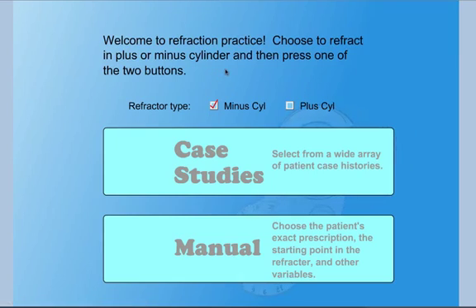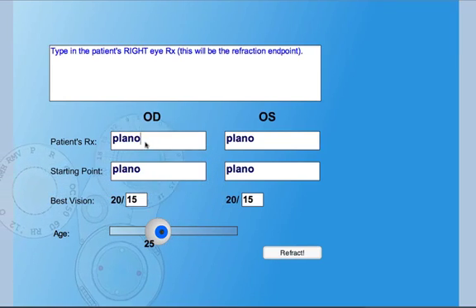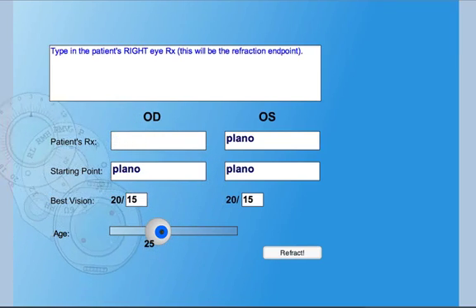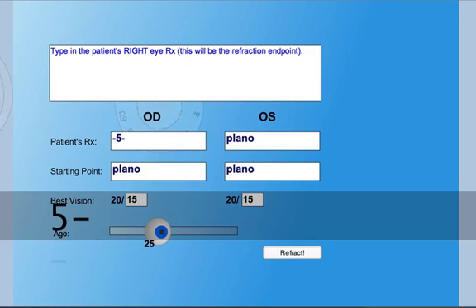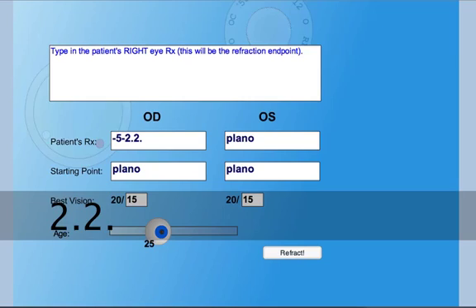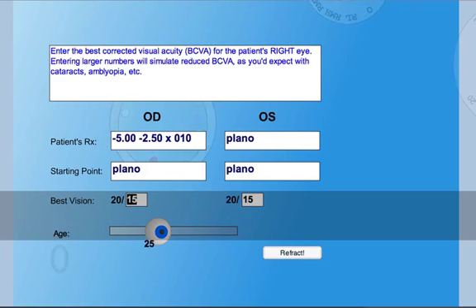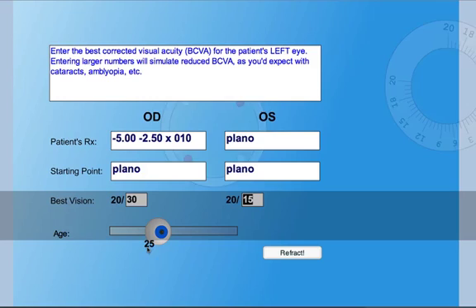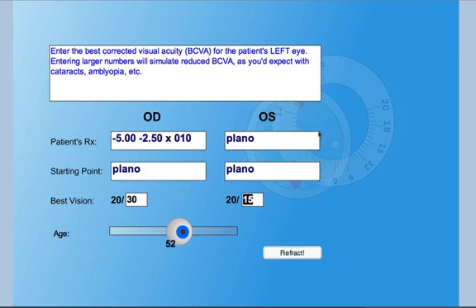On the simulator, you have the option of practicing in minus cyl or plus cyl, and you can either do a manual option where you can enter the prescription that you want to refract to — so let's say minus 5, minus 2.50, axis 10 — and enter the patient's best vision and their age, which will affect how well they accommodate, and refract from there.